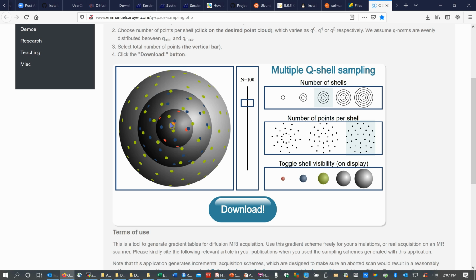One thing that will come up repeatedly today is BVALs and BVECs. The BVEC is the tensor direction of this, and I'm using tensor in the vector sense, so the multidimensional vector. This will create a good selection across those gradients, and the BVALs are at what shell level those are collected at. You've also got your zero BVALs, where you can ignore any concern about your tensor direction or your gradients because you don't give it enough time to ever collect along that. So you have zeroed out those, and you're better off again collecting more at this outer shell.